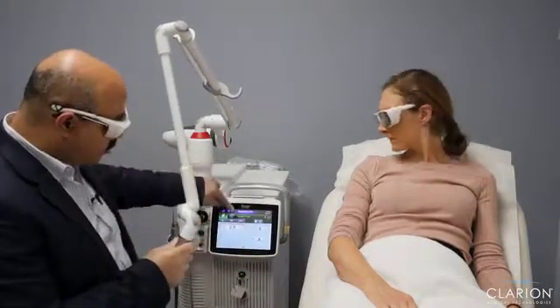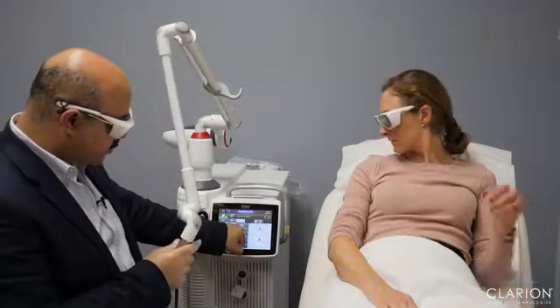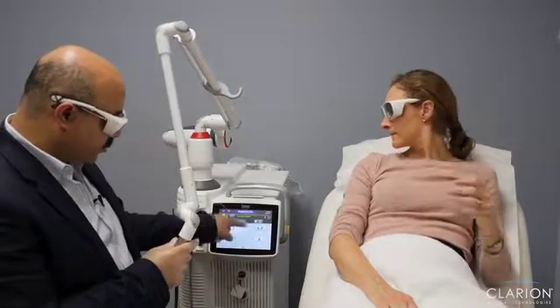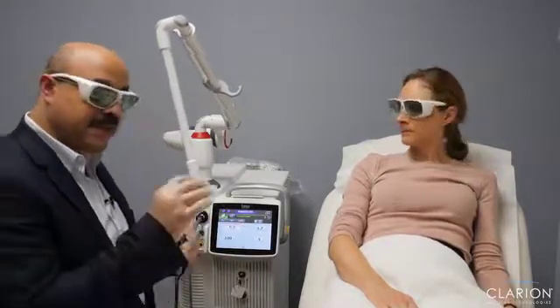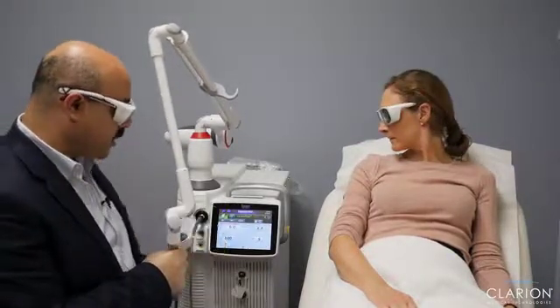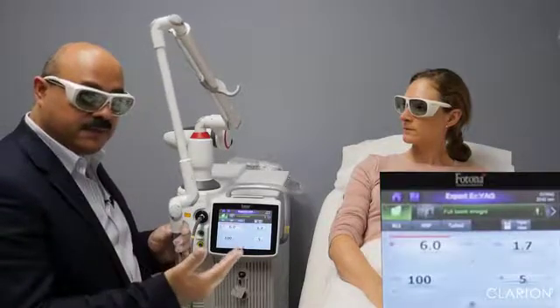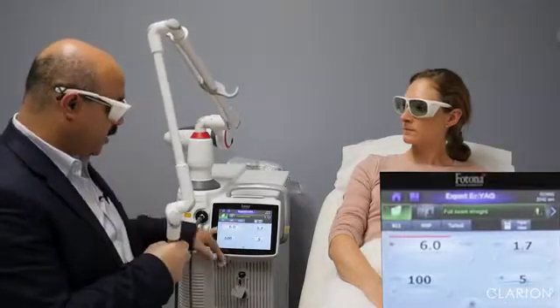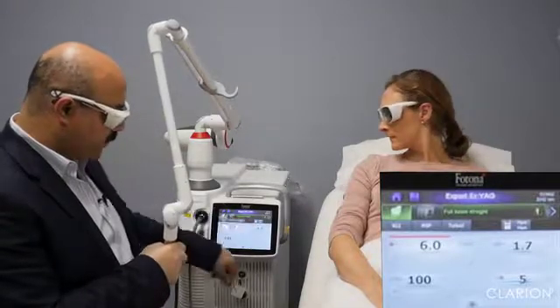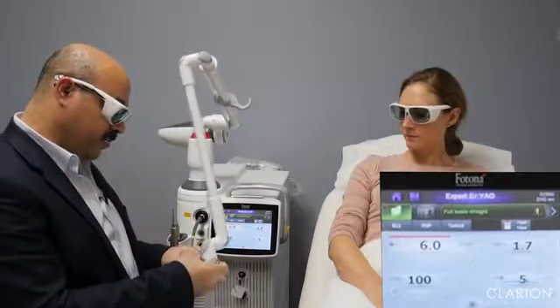So in this case, I go for something called turbo, where we can get stacking of pulses. So instead of basic, we go for turbo 2, and turbo 2 means stacking of 2 pulses. In this case, we are ablating 15 microns of the epidermis, and this will give us a much better improvement and faster result. So now this is 6 joules with the turbo 2, 1.7 hertz, 5 millimeter spot, and this is what we are going to be doing now.